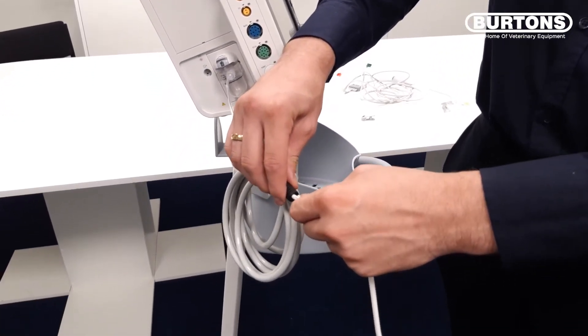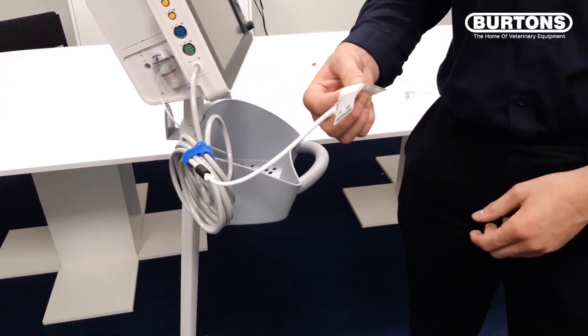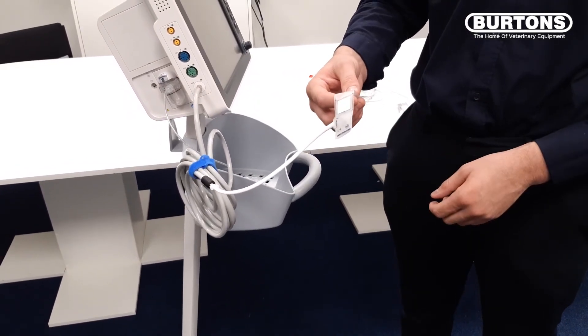We will just slot onto the plastic end of the blood pressure hose, and there are a range of blood pressure cuff sizes included in the accessories.